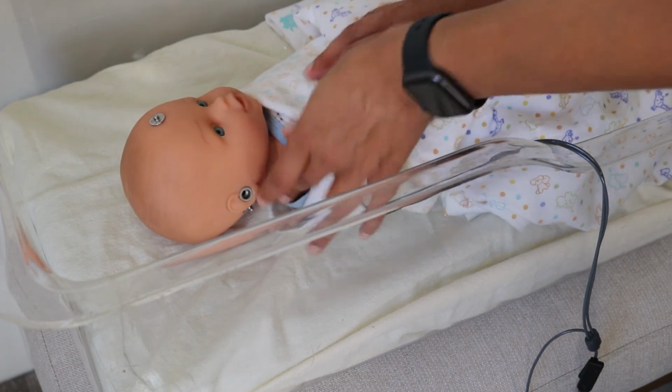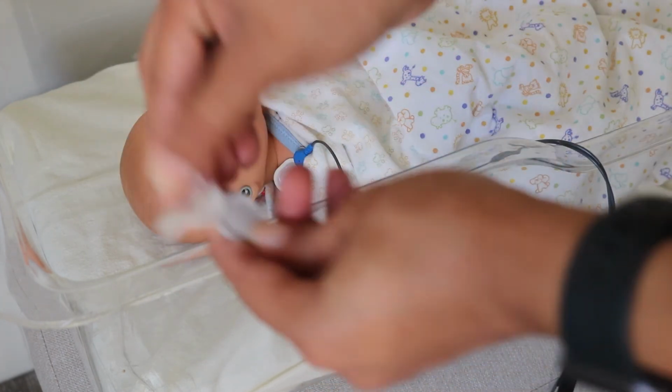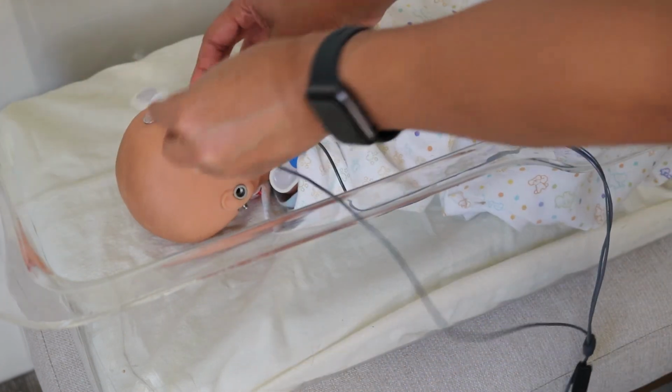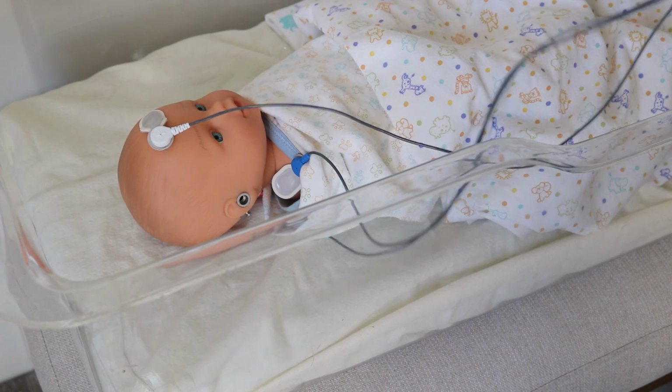The electrode connected to the white or black lead, depending on the model of the SmartScreener-Plus you're using, goes on the forehead, in the center and as close to the hairline as possible. Allow some time for the electrode conductive gel to be absorbed into the skin. This is why we place the electrodes first.